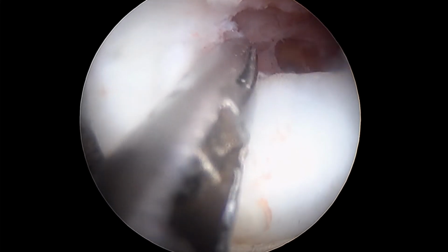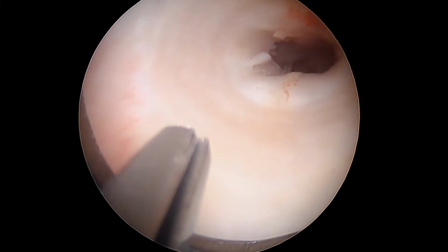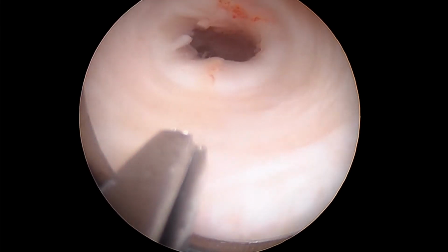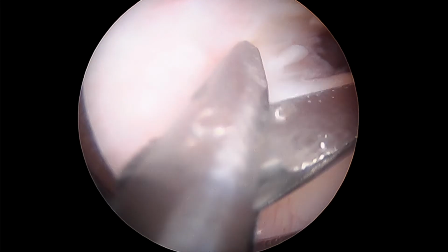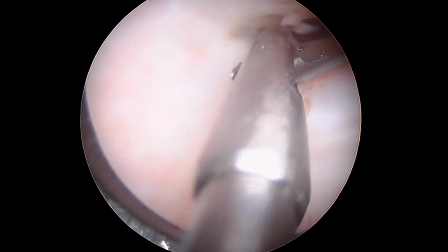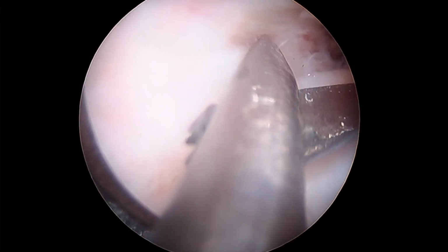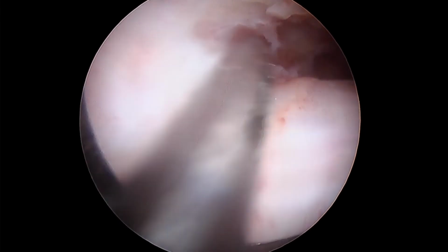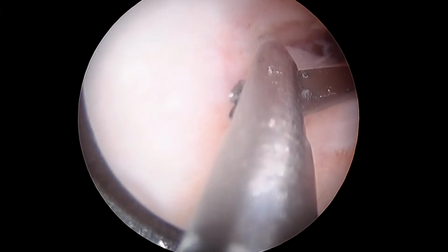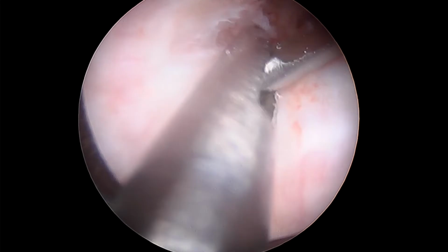Most times you have collapse of the cavity, and then it becomes exceedingly more difficult for you to distend the uterine cavity. Or sometimes you can even see bowel through the serosa of the fundus of the uterus. So care has to be taken while doing this.